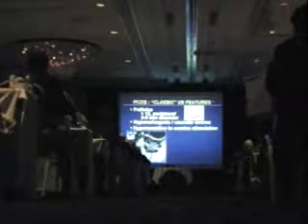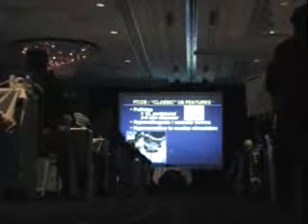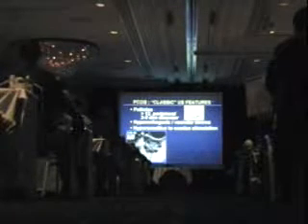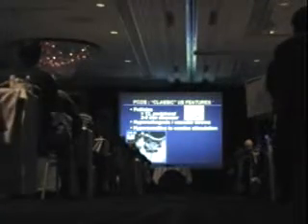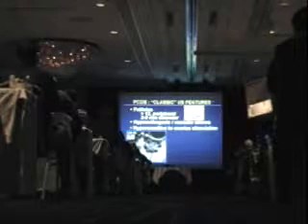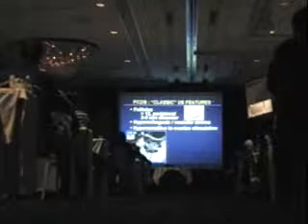Now, what about polycystic ovaries? Well, we know there's an appearance that we have in our mind. The ovaries tend to be somewhat large. They're more spherical than a normal ovary would be. And the rules that are used to characterize these ovaries are no follicle greater than a centimeter, okay? And usually around the periphery, at least 12. And they kind of resemble, if you will, a string of pearls around the periphery of the ovary. These ovaries are often hyperechogenic, and I'll emphasize they have vascular stroma.